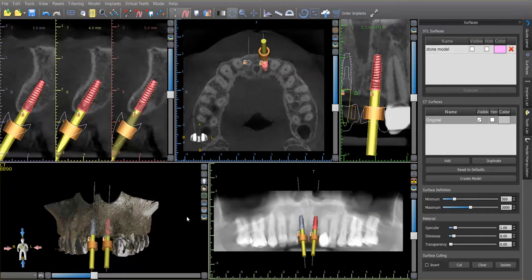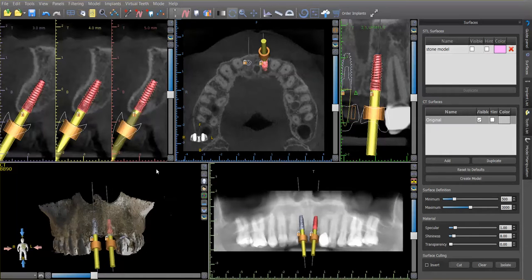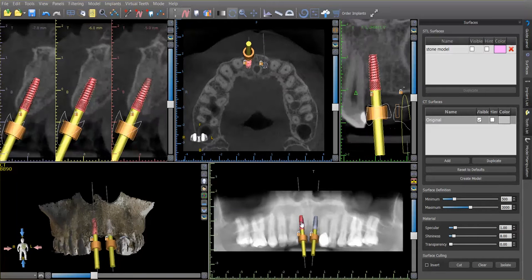This is a great case to do such a thing. This patient is missing number eight and number nine. It's got tons of bone as you can see when we go through each implant position. There's just plenty of bone and so I have no doubt that we can get great primary stability on this case.